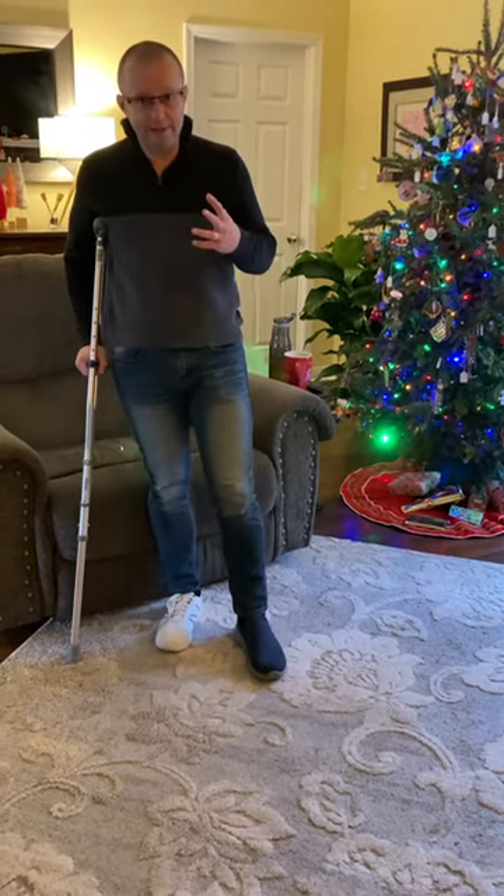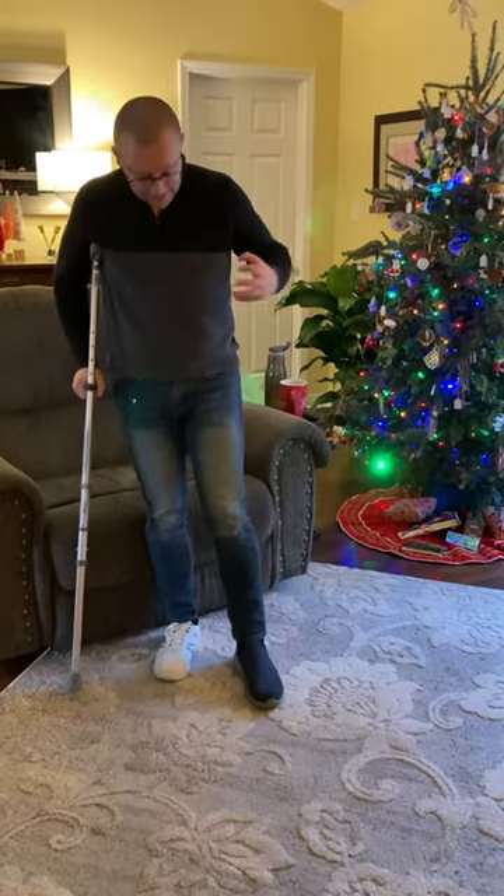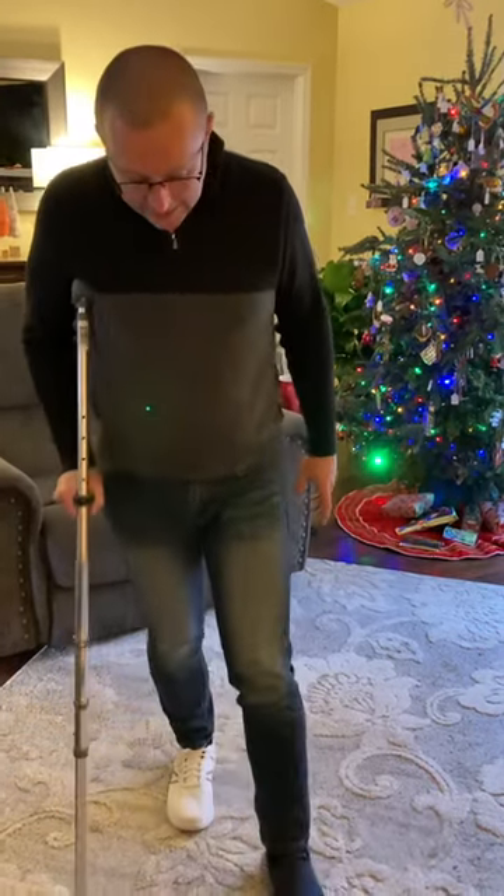I'm getting off crutches in a week or in a few days, hopefully. And I want to show you guys the way to do it — it's like this.